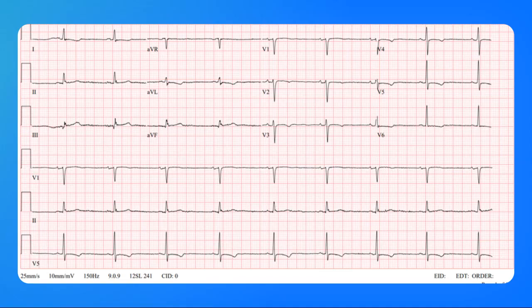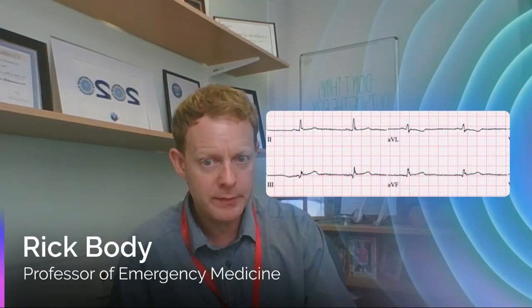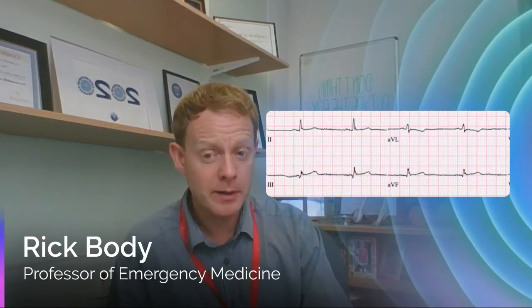Now, some of you will have noticed it, and some of you may not have noticed the inferior STEMI. So let's go through the leads, focusing in to see why that is an inferior STEMI. Let's focus in on leads 2, 3, AVF and AVL — that's where we want to look for our inferior STEMI predominantly.